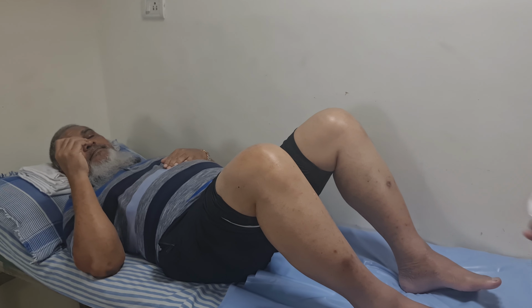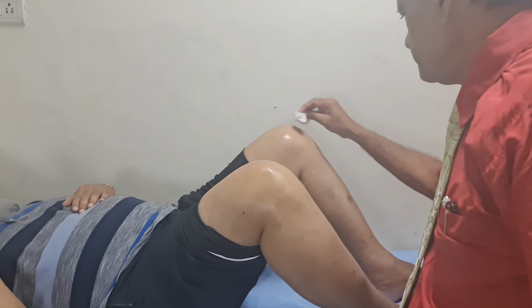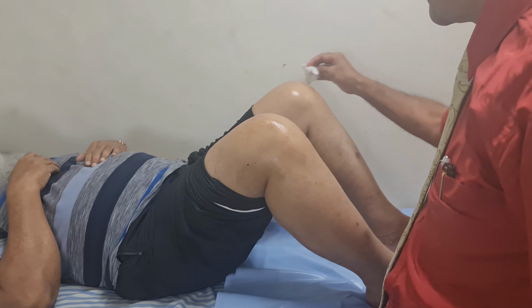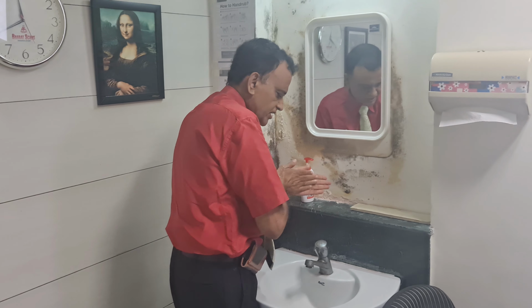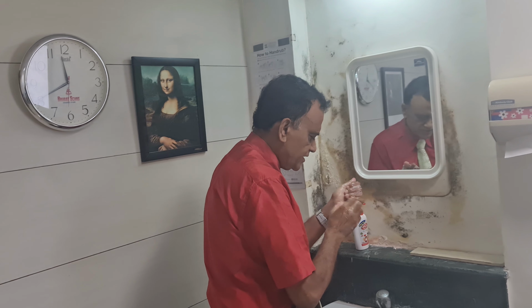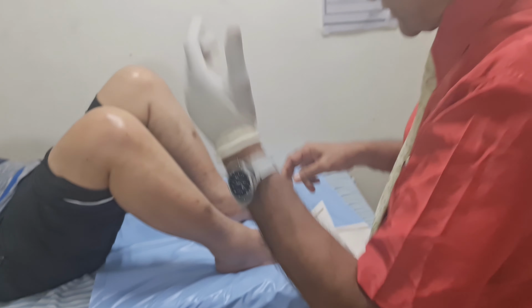I am now cleaning this area and applying local anesthetic cream to the area. I will be injecting the portal with the local anesthetic using a small needle. First I wash my hands with soap, then I apply antiseptic sterilium to my hands and don a pair of sterile gloves. I am wearing sterile gloves.